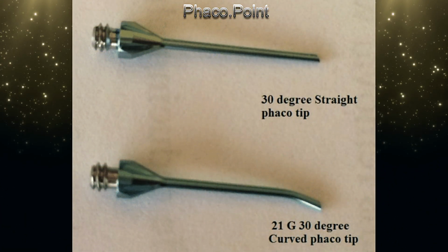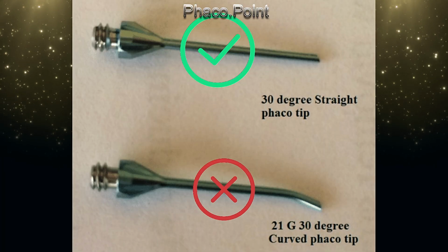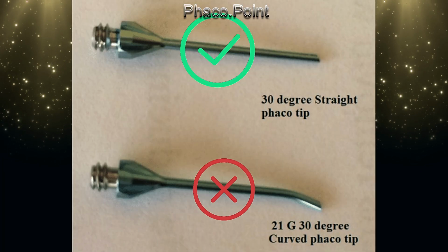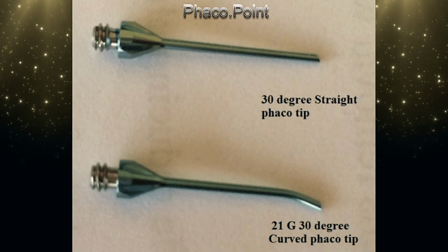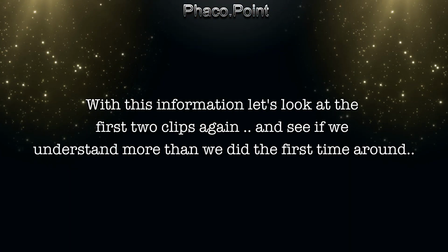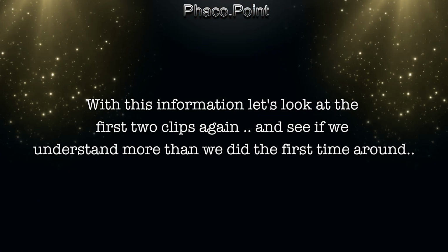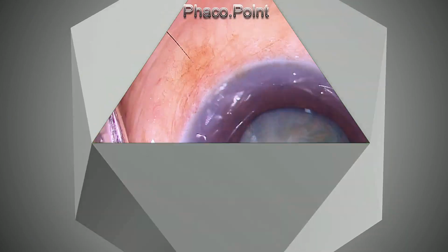Unfortunately, this sign could be applied only if you're using a straight tip, and it cannot be used for a bent tip. It can be applied to all types of tips, standard tips, ABS tips, or even Cobra tips, as long as you're holding the tip in the bevel up position, which is the only drawback. With this information, let's look at the first two clips again and see if we understand more than we did when we looked at it the first time around.